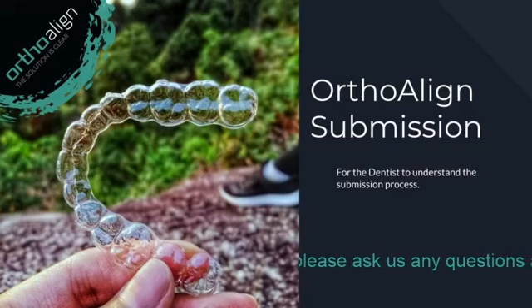Okay, so the next thing that we can go to is the photos. What kind of photos do you need to send to us? This is a lot of questions that we get from our customers. They ask what photos do you need, and what angles are the photos going to be, especially if you're a first time user of our OrthoAlign system. Some of the criteria that we have is we definitely want high definition pictures of the patient. We want to make sure that the photos are clear and not blurry. The clarity has to be there.